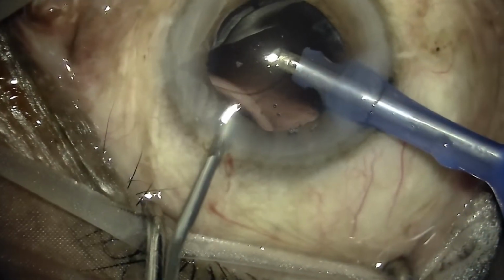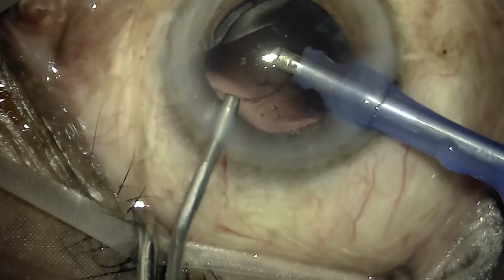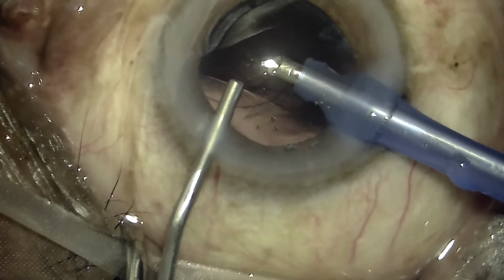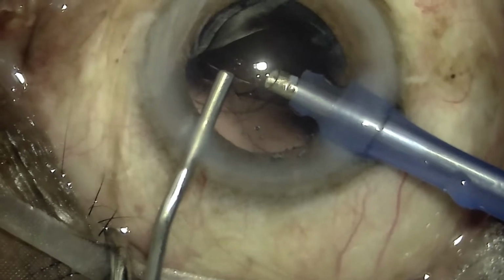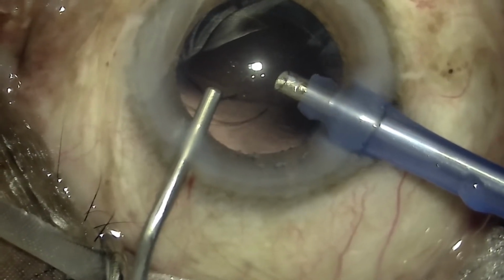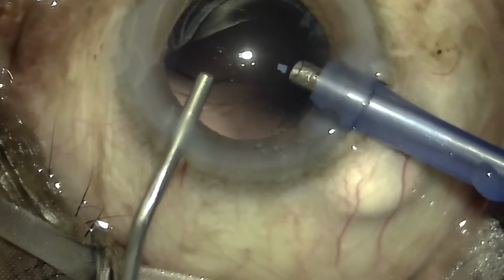Now, what to do in such a situation? The first thing is not to withdraw your phaco handpiece, stop aspirating, keep the irrigation on, and fill up the chamber with viscoelastic, which will not allow shallowing of the anterior chamber when the probe is removed.